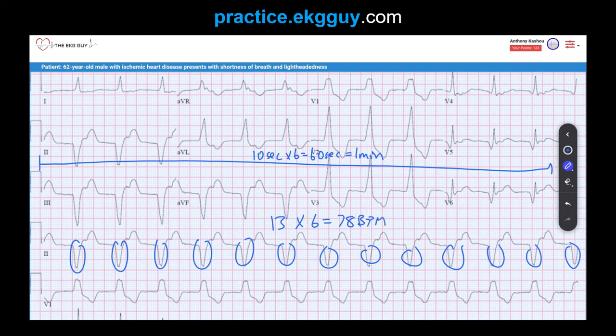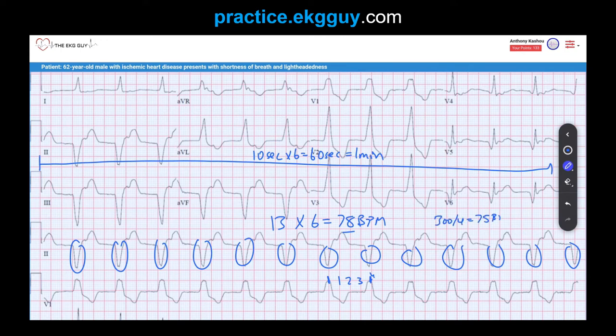Another way to calculate rate is by taking an R wave that falls near one of those thick lines, finding the next R wave, and counting the large boxes. Here it's just under four large boxes, so you do 300 divided by 4, which is 75 beats per minute — slightly greater, but a good approximation.